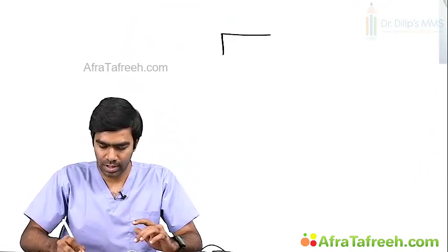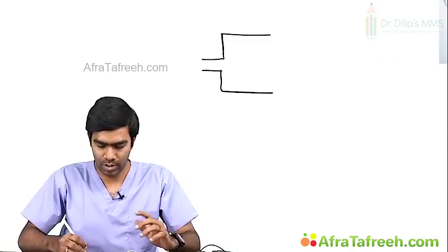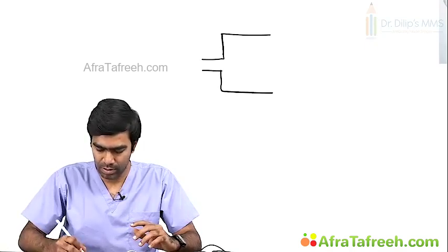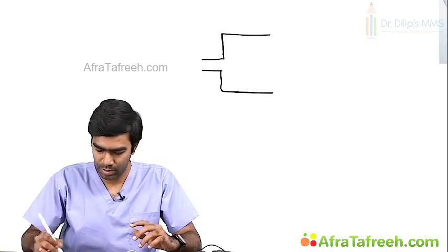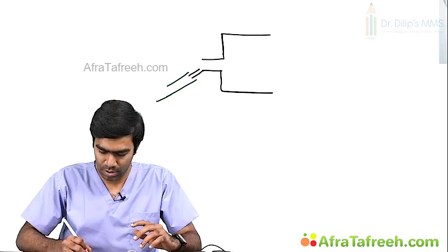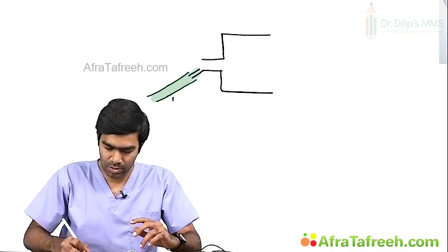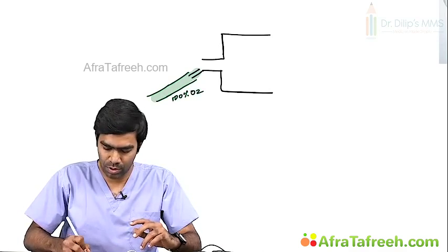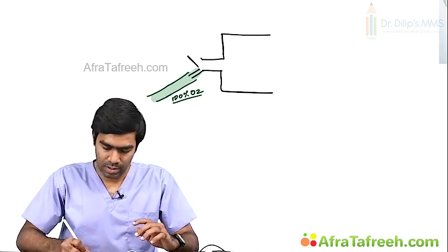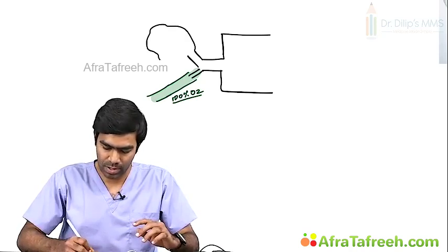So let us draw only the inlet area now because we are concentrating on that only. This is the oxygen nipple that is connected to the oxygen tubing, which is going to put a gas flow of 100% oxygen, whatever flow rate you put. And now let us assume this reservoir area is properly connected to a reservoir bag.